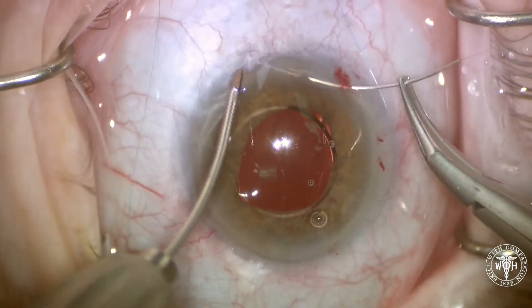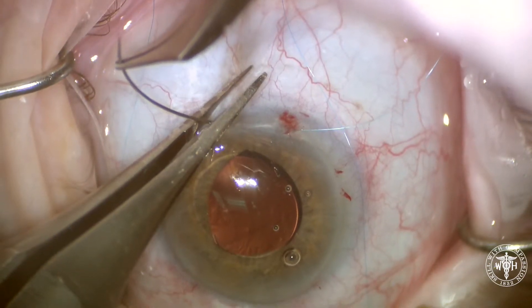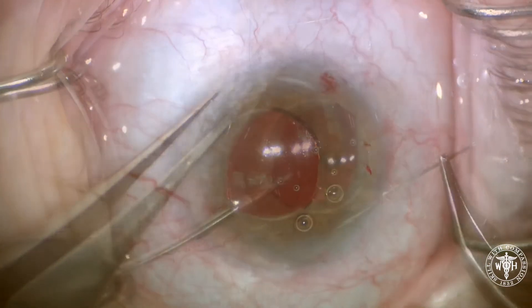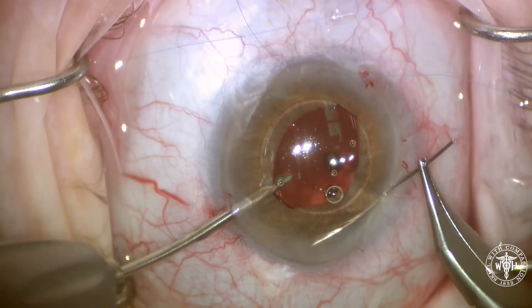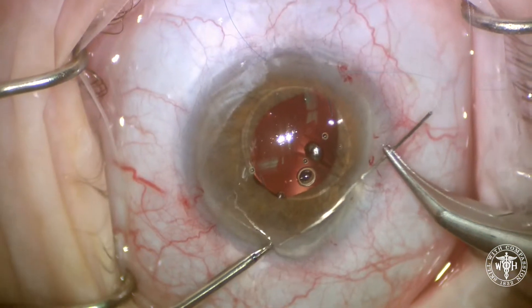Then using a 10-0 prolene on a CIF-4 needle, we're going into the eye through a paracentesis underneath the haptic. You can just stab that needle right out through any incision — you don't need an exit wound. 180 degrees across, we're going to find the other haptic.